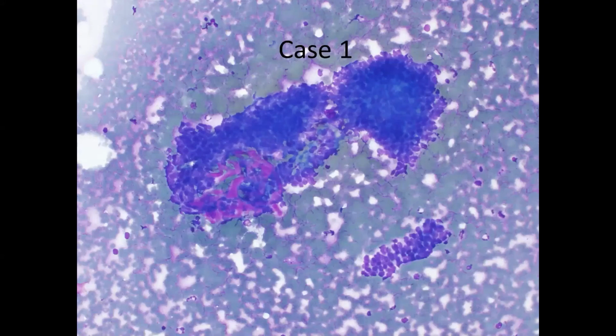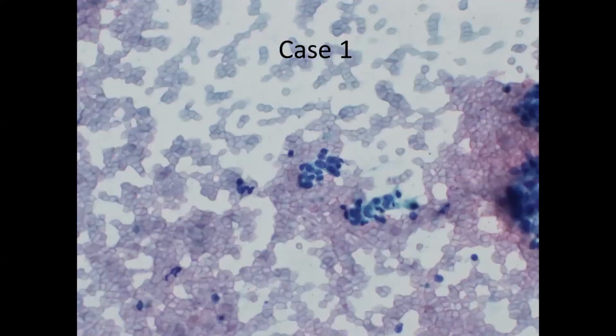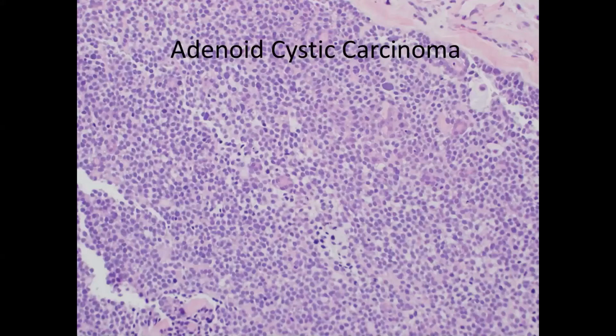So a couple of key points are illustrated here. First of all, in this pattern, it can be very difficult to reach a definitive diagnosis. And secondly, if you do have hyaline stromal material, that should get your attention, because it tends to be more associated with malignancies versus benign neoplasms. So recognizing hyaline stroma is important, and recognizing that this category is hard to reach a definitive diagnosis with most of the time. But in this case, this is a solid adenoid cystic carcinoma.